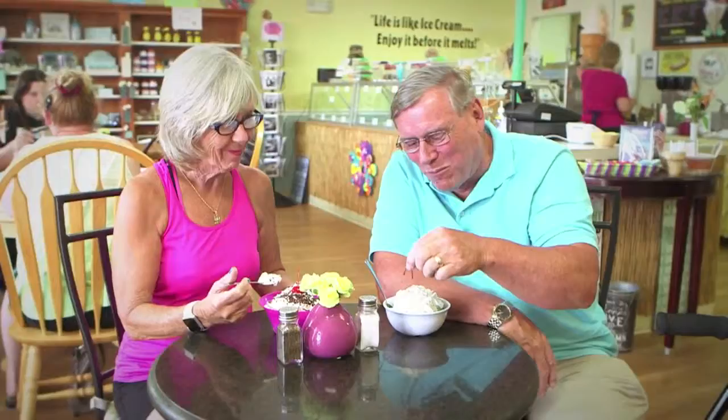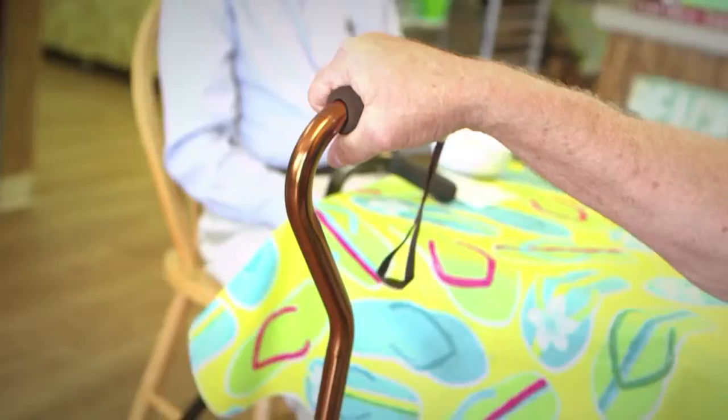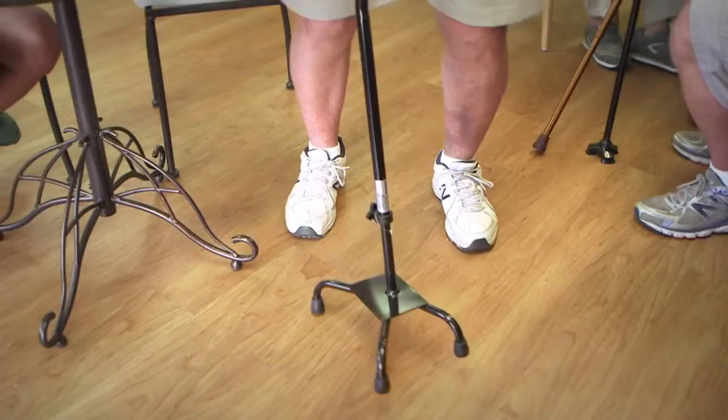I've been using a cane like this for about four or five years now. The biggest thing I find with it is that if I go into a store where there's not much counter space, as soon as you let go, it wants to fall over. Then you have to bend over and pick it up — bending over is not an easy thing for me to do. As you see, as I get up, I have difficulty getting up out of here with just the one handle. Also, it's offset, and if you have that on the wrong side, you're also a trip hazard with this particular cane.